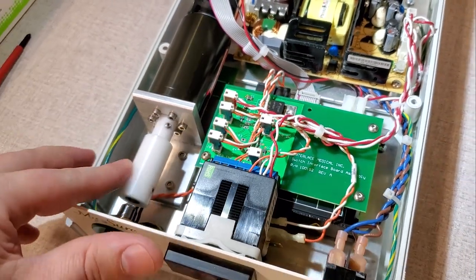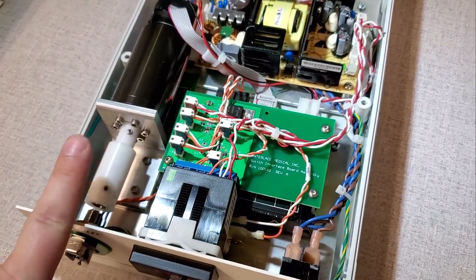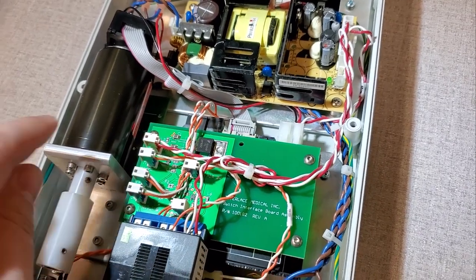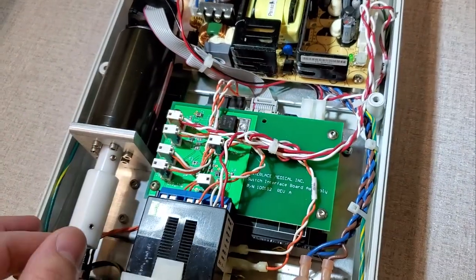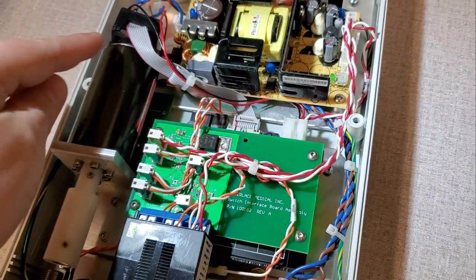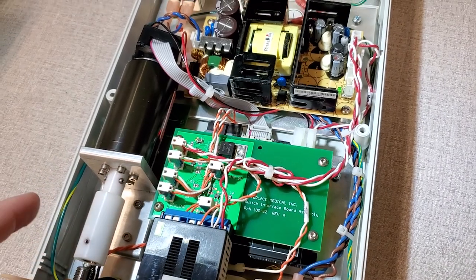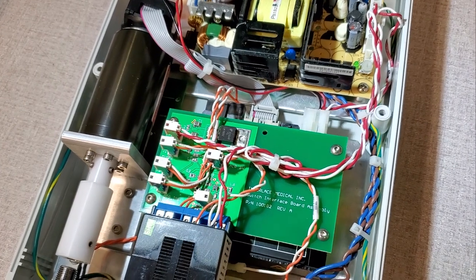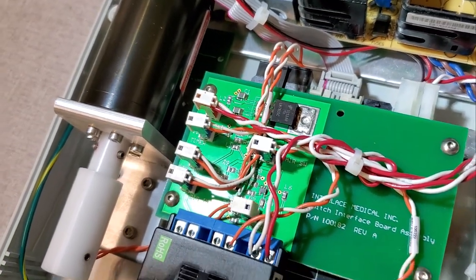So if your cutter head right here, this actually is like a cable drive cutter head, experiences a jam or something, then this will throw an error code and it immediately stops the cutting process. Because there's a feedback. It knows that it didn't spin enough revolutions for what it was requested. You can see the green status flashing down there on the motor.